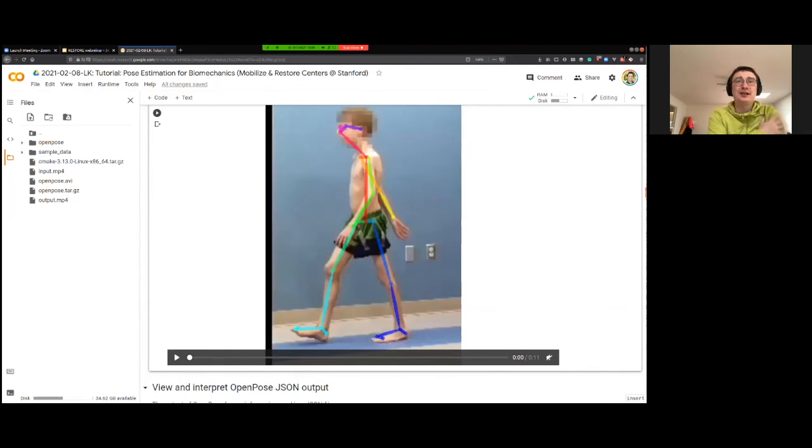The people who were annotating those large data sets that OpenPose was trained on knew where the knee center is as per their protocol, but not necessarily for what we are interested in biomechanics. All that could be improved by annotating better data sets, by collecting better data.